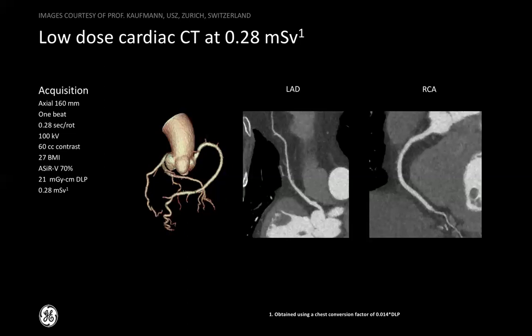Remember back a few lectures, we said that 3 millisieverts is what you obtain just by walking around for a year as an alive human. So 0.3 millisieverts, you can't imagine that it modifies your cancer risk that much, given that the baseline rate is 3 millisieverts.